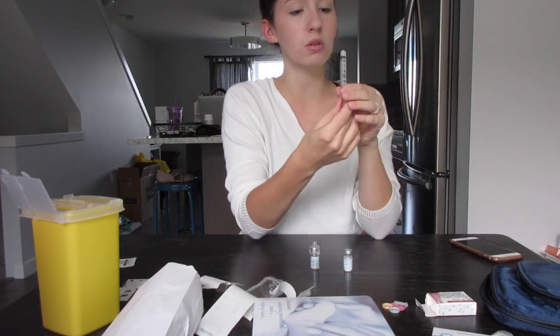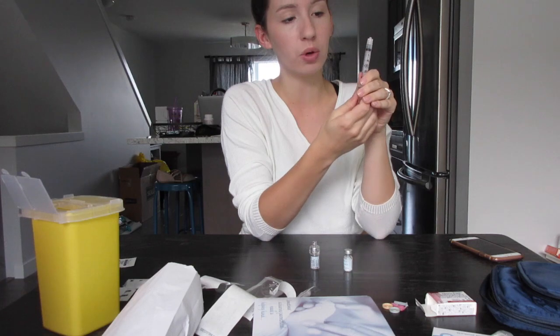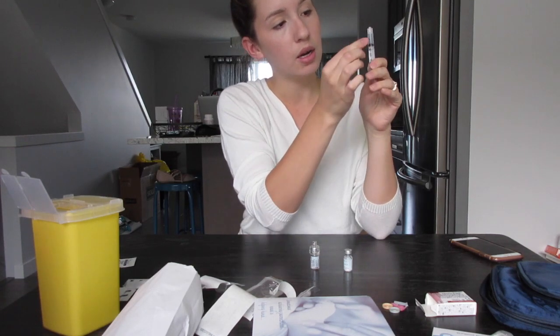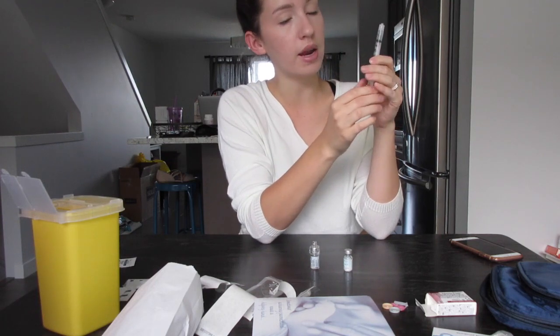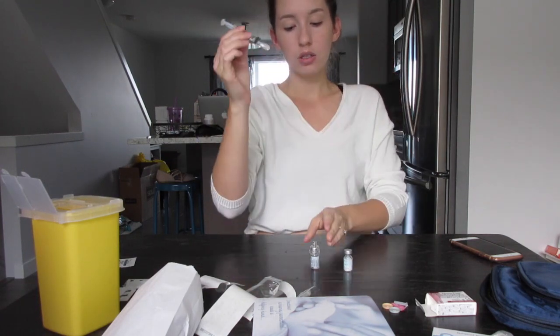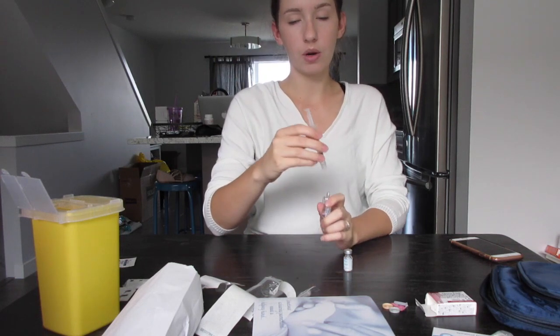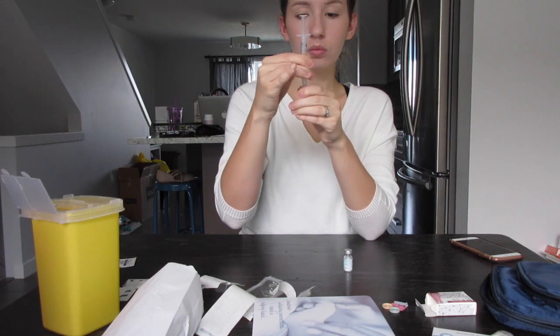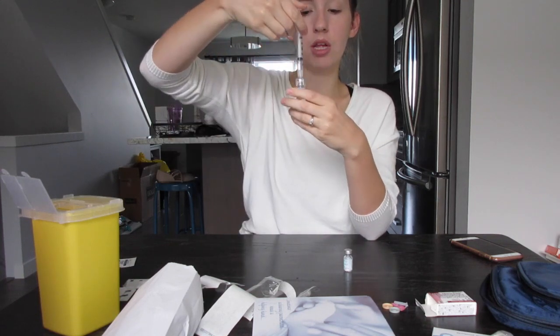So first thing you do is you take your syringe and you actually put air in it. You'll go all the way down to number one and you want that air in it. So this air just makes it easier to take the liquid out afterwards of this vial. So you'll screw this on and you'll push the air in.